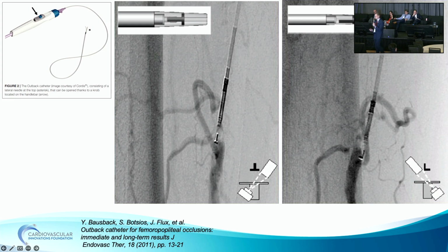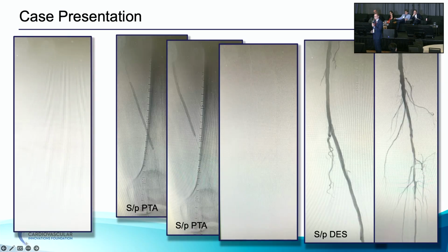You also want to understand that the needle is 7mm, so where the needle comes out and where it's going to enter has to be close enough to where exactly you want to be. You don't want to dissect with your wire too far, and you don't want to re-enter too far down. So that's what I did. I used the Outback re-entry here, past a small catheter.